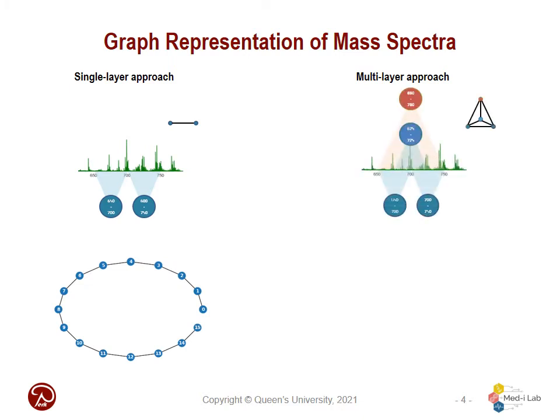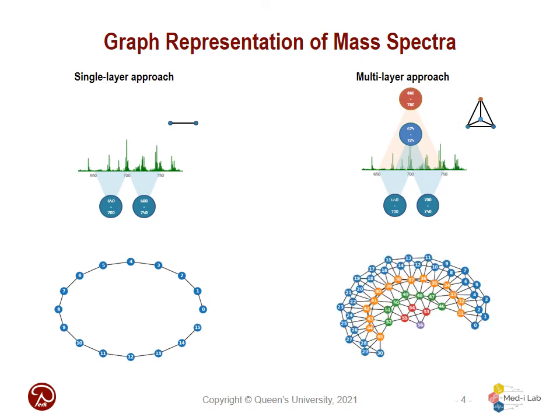In our second approach, we considered 50% overlap between subbands and a multi-resolution level architecture. Edges were created between immediate neighbors as well as between subsets in immediate resolution levels. We continued this until the entire range was represented by one node and 50 features, and the spectrum was converted to a graph with 57 nodes.